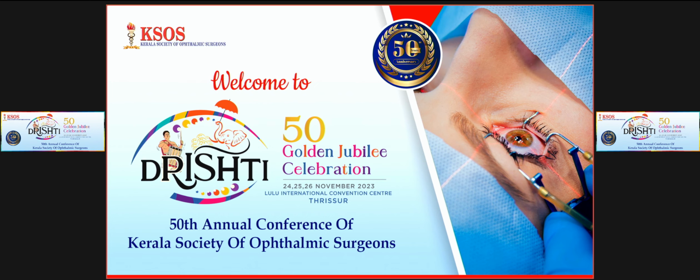So, release it. And that is also tricky. When the nucleus comes, will it bring the hook along with it and touch it? If you are scared of that, remove the proximal ones, totally remove it. See, once it is SICS, the big nucleus comes out, you will have enough space in there for IOL implantation and cortex wash. That won't be much of an issue. Okay, thank you, Dr. Srini.